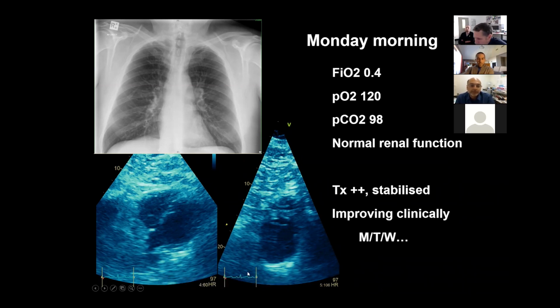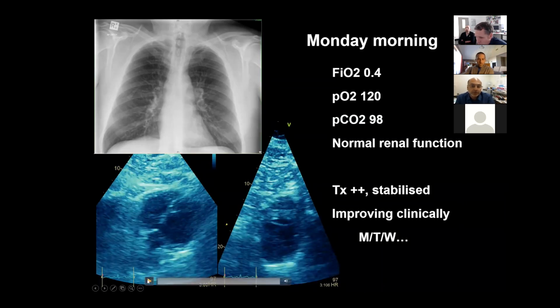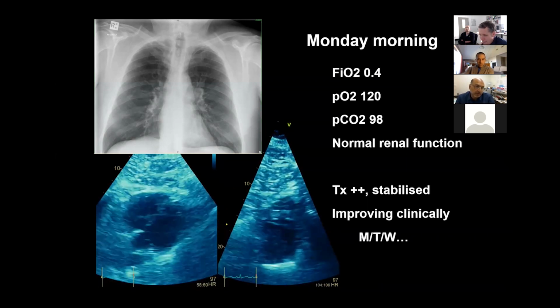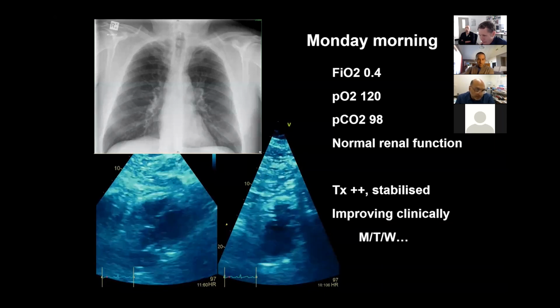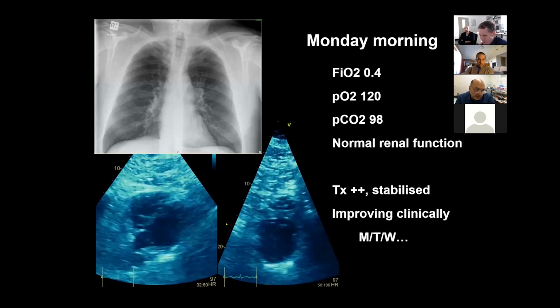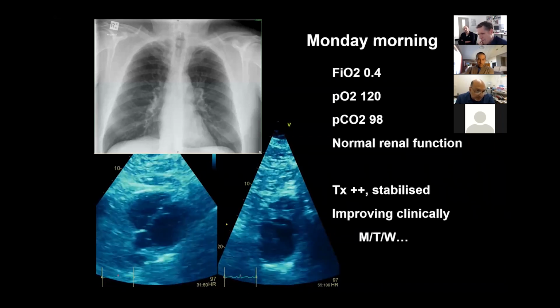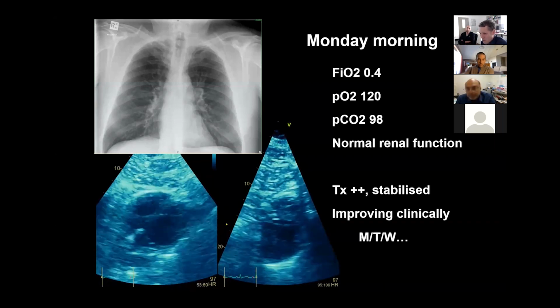Yeah. So obviously this patient is very hypoxic, tachycardic, and CO2 is very high, and the pH, I presume, is going to be low, and all of these factors are causing this dilated right ventricle, I can see. There is a good, I guess, radial contractility of the right ventricle. And on the right atrial side, septum might be deviated onto the left side, I guess. But it's very hard to know. Yeah, I think I'm giving a terrible picture, aren't I?